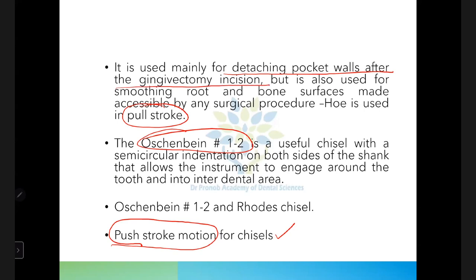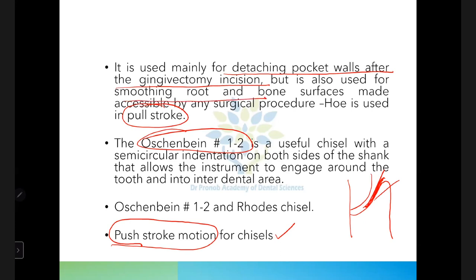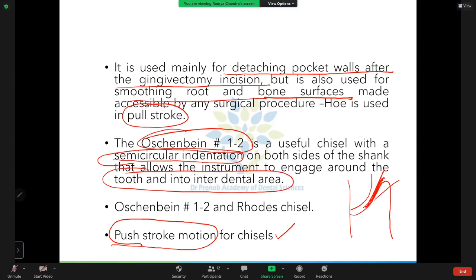Hoes are used mainly for detaching the pocket walls after the gingivectomy incision, and also for smoothing root and bone surfaces to provide accessibility. The Ochsenbein chisel has a semi-circular indentation on both sides of the shank, which allows the instrument to engage into the tooth and interdental area.